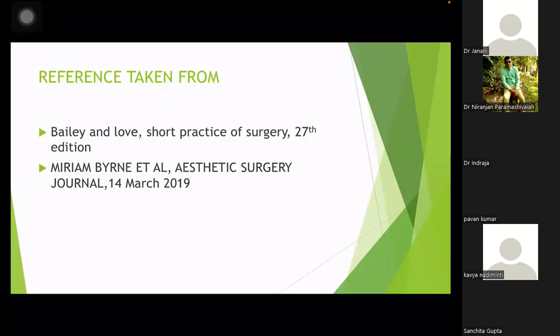And even when it comes to abdominal closure, for a virgin abdomen, a standard laparotomy for elective procedures, use a continuous PDS as per Jenkins rule, 1 centimeter across, 1 centimeter apart, which means the suture should be 1 centimeter across and 1 centimeter apart.